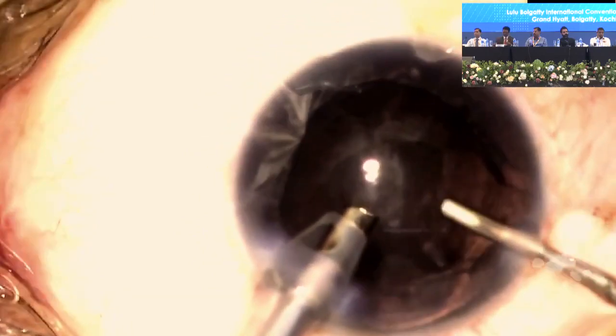It's a very soft cataract, so the only aim is to not do any kind of lateral separation, reduce the manipulations in the eye, and virtually hold on to the nucleus, bring it up, and aspirate it, which is what I did. At this stage, the crucial step is to perform a viscofluid exchange. Whilst performing the viscofluid exchange, you're going to negate the chances.